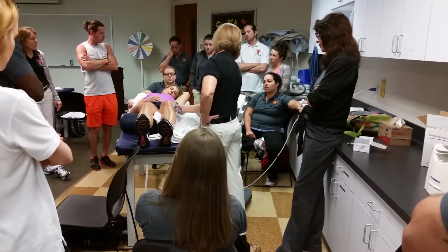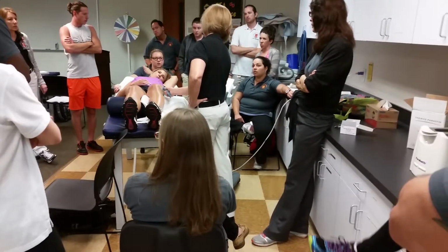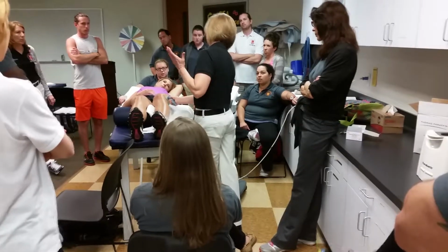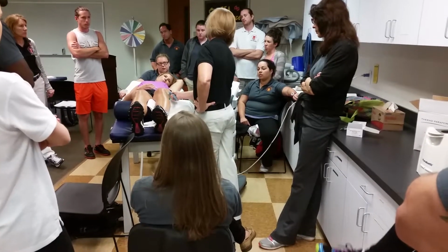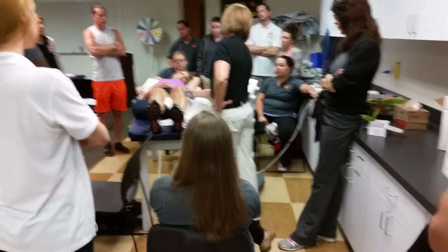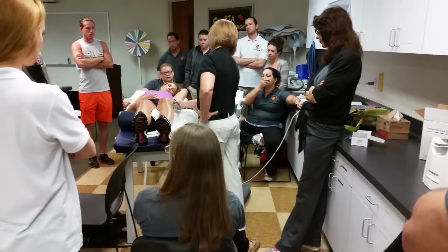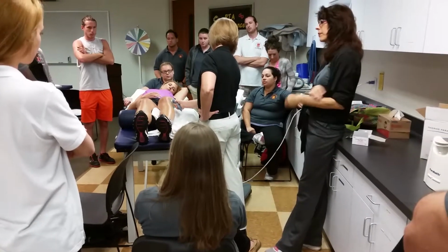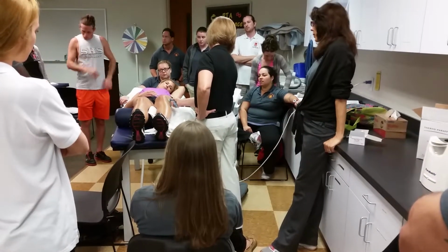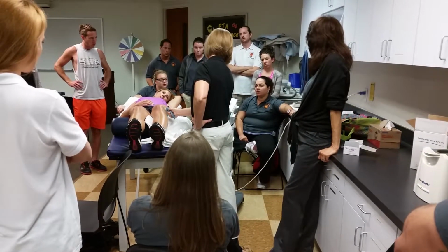So you consider the treatment time from the point at which it starts to have an effect, or just the whole treatment? I don't calculate it out. It was 6.5 minutes. It's close enough. Remember, it's 5 to 10 minutes to be effective. Did we turn it up to 0.8? 1.0.